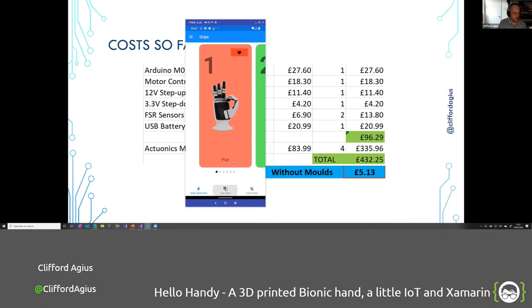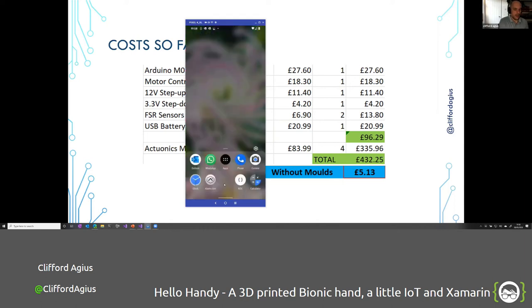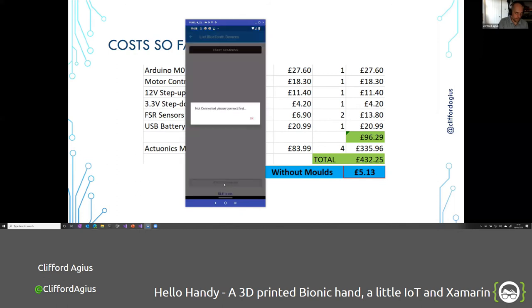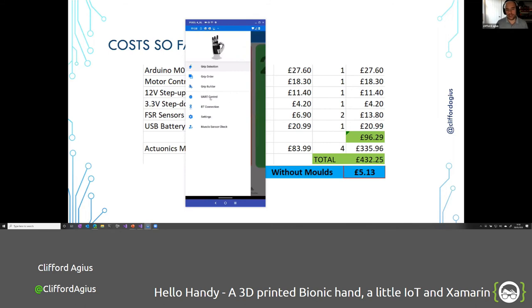In the Grip Order screen, it shows a long list of favorited grips that you can reorder and move about, then save using a big save button at the bottom. The app crashed there — I know why, I thought I'd fixed it but I didn't. The idea is you can change the grips and order without needing the hand physically connected. The flyout menu below the gray line contains the extra fly items I mentioned — Bluetooth connection, settings, and muscle sensor check.